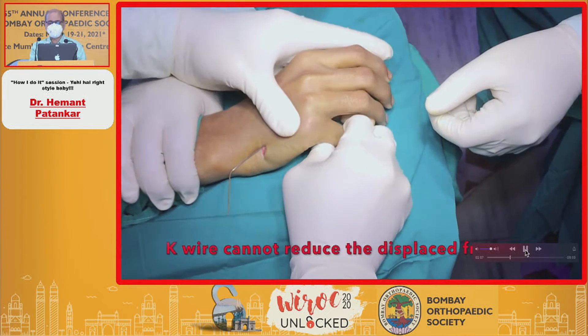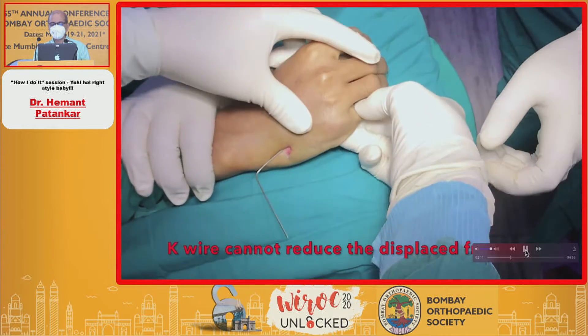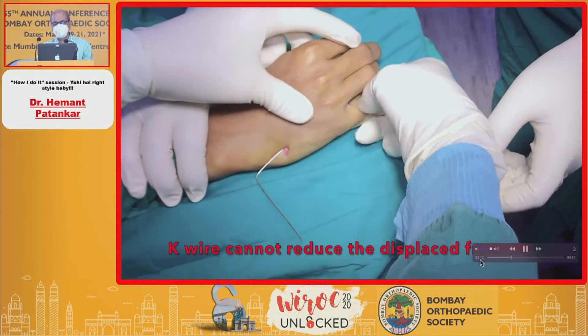Remember that the K-wire cannot reduce the displaced fracture. You have to reduce it manually, and you can see this point here.